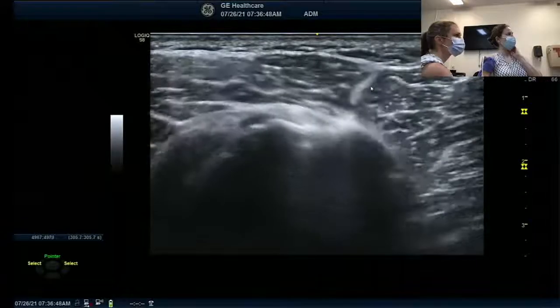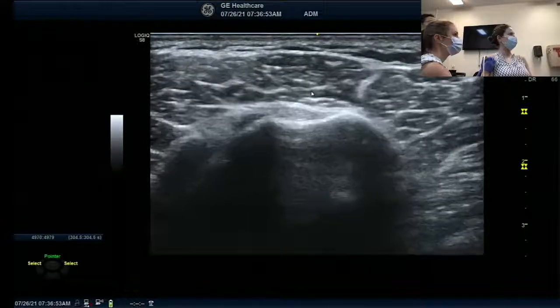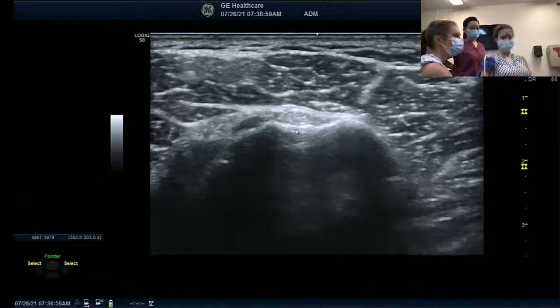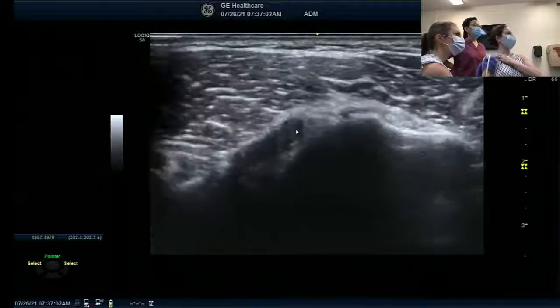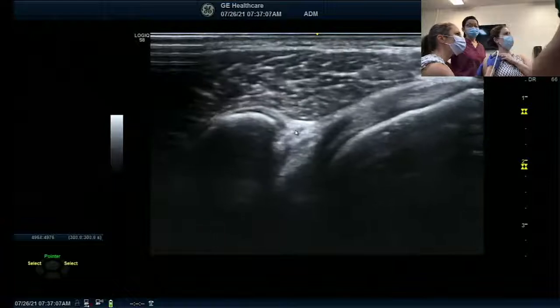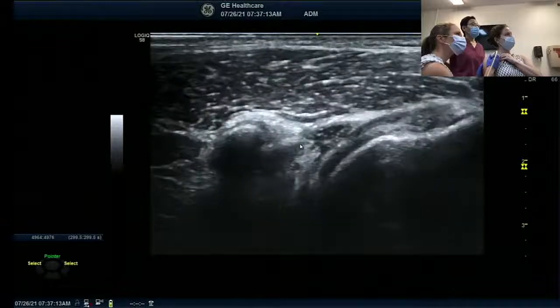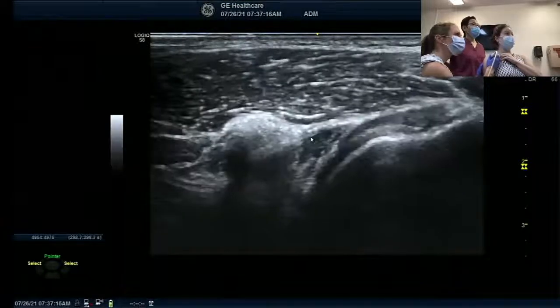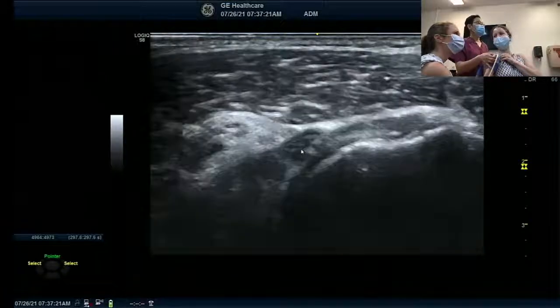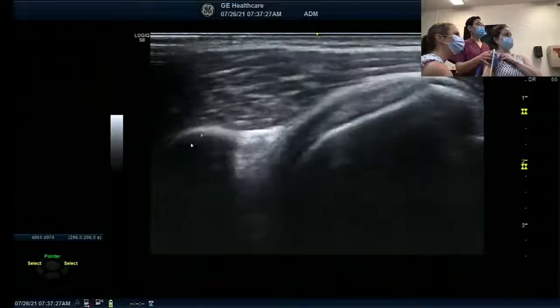You could go medially to see where the coracoid process is, a little bit higher. Externally rotate. So now we can see the subscapularis tendon — it's sub-coracoid. That's the subcoracoid bursa. Can you make the coracoid process part clearer? That's already a muscle right there.